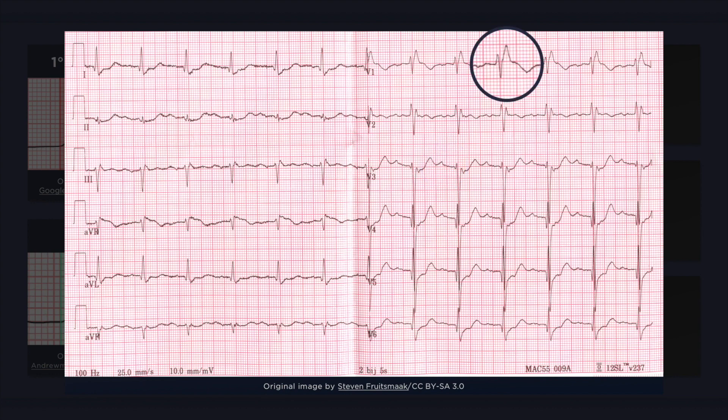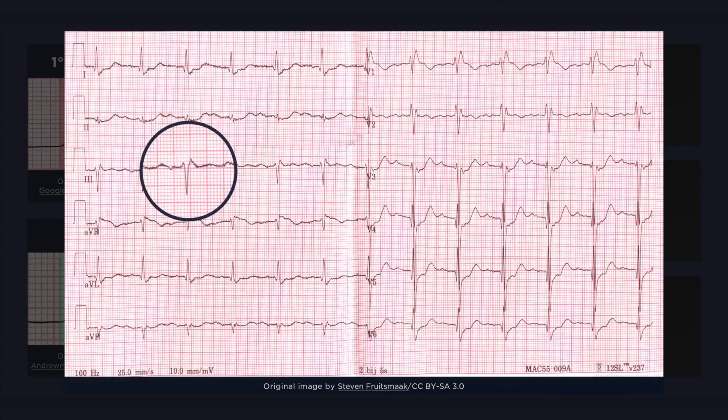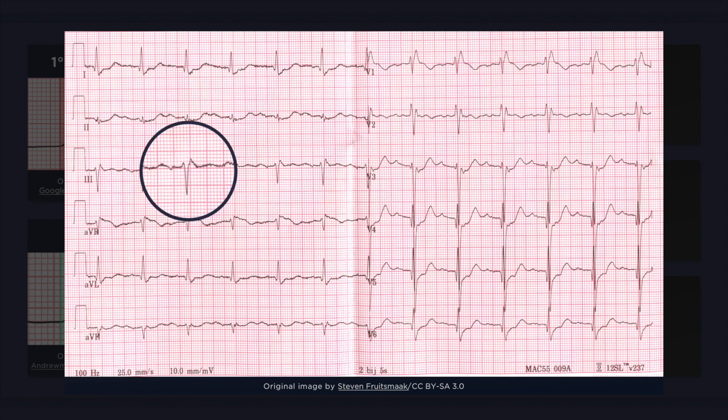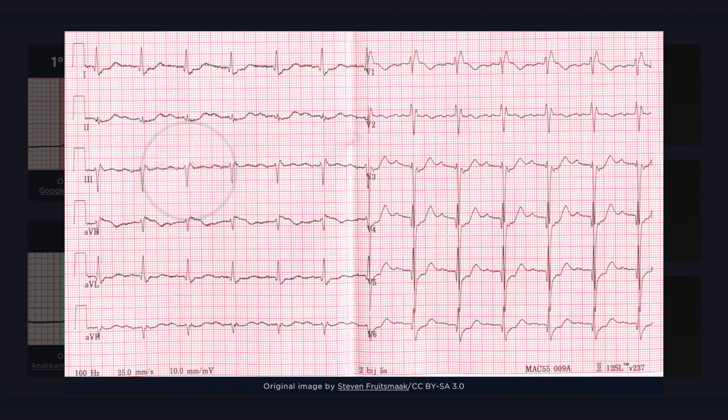In addition to the PR interval prolongation, there are also features suggestive of a right bundle branch block, note the widened QRS complex with a bunny ear pattern in V1. And there is also a left anterior hemiblock, note the left axis deviation and an initial R wave followed by a deep S wave in lead 3. I will discuss these other findings in subsequent lectures, but I'd like to briefly mention that the presence of these additional conduction abnormalities suggest that the defect resulting in PR prolongation may be located somewhere below the level of the AV node.